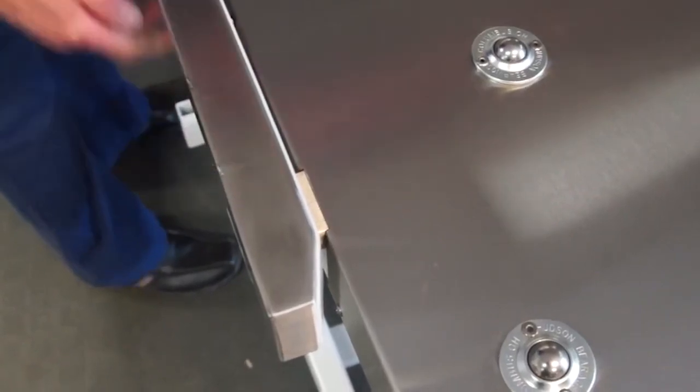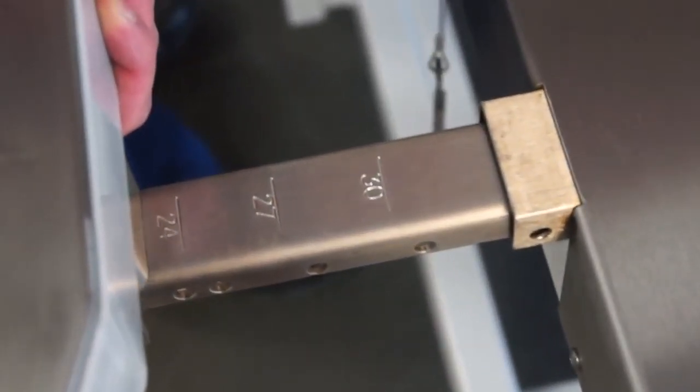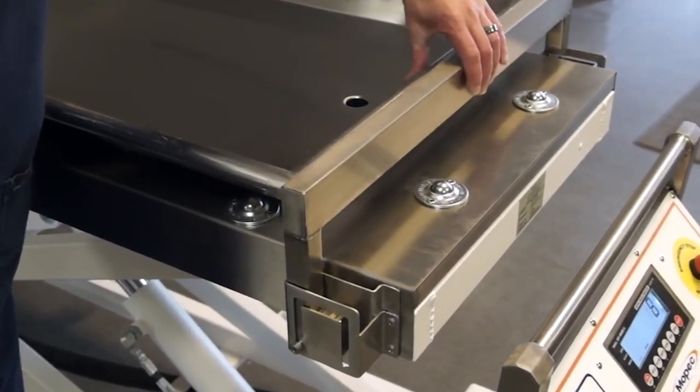The sliding adjustable side rails are easily secured with the locking pin to accommodate various tray sizes ranging from 23 inches to 32 inches. Lift tops can also conform to various lengths using the slide and lock mechanism.